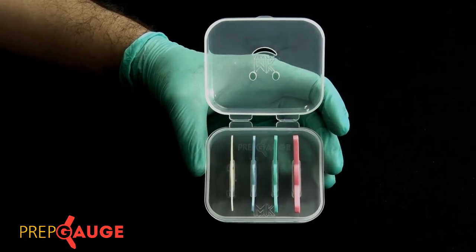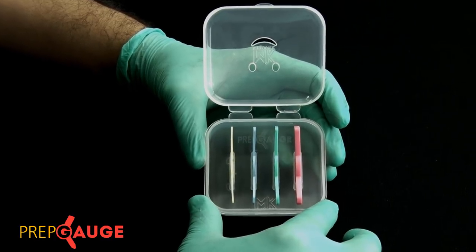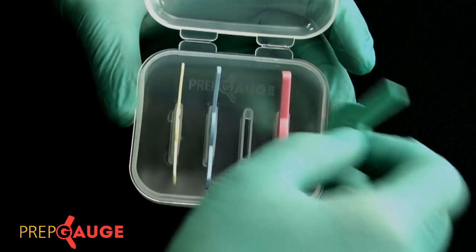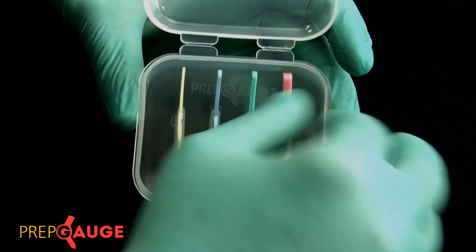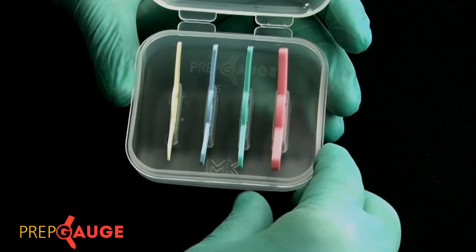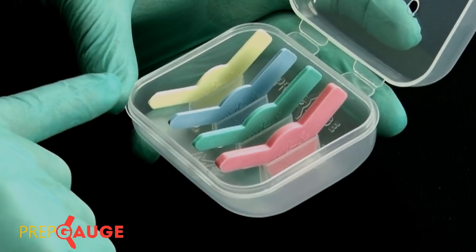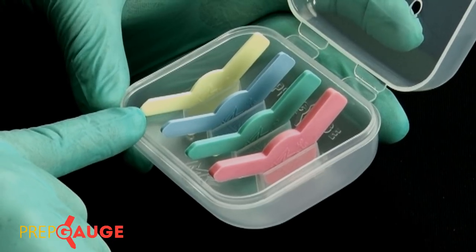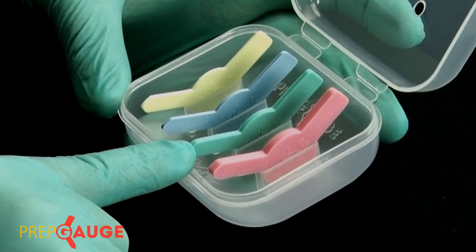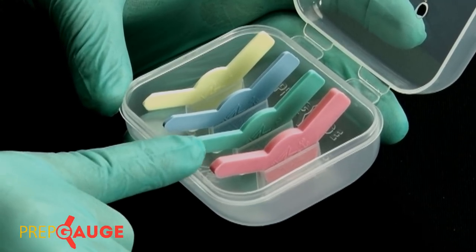PrepGauges are these four food-grade silicone strips that are completely autoclaveable, provided in this convenient-to-use case. The concept behind the design is that each gauge can be used and placed back into its respective vertical slots, allowing for ease of use. With respect to thickness, the four gauges have been given color codes: the yellow one is 1 millimeter, the blue one is 1.5 millimeters, the green one is 2 millimeters, and the pink one is 3.5 millimeters.